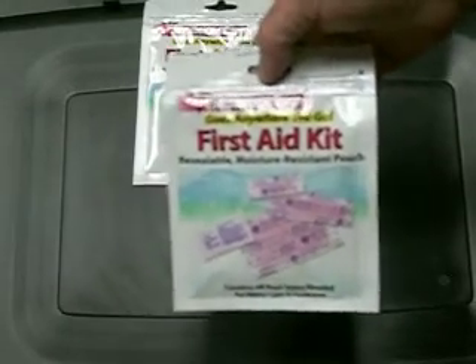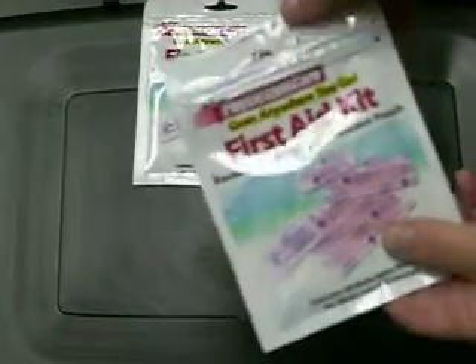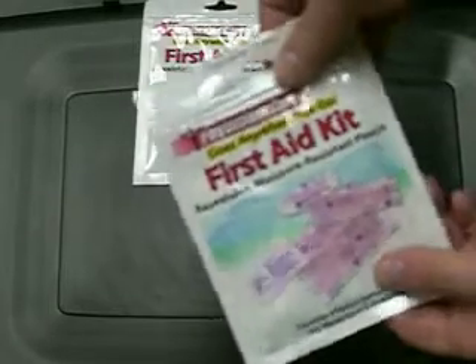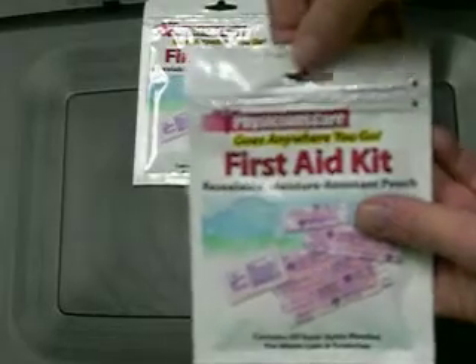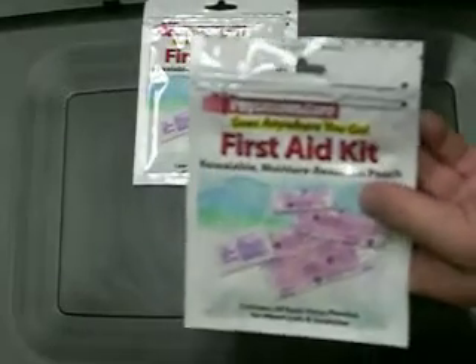Welcome aboard another CountyCom video. Today we're excited to talk about the new Pocket First Aid Kit that we're carrying. The outstanding feature about this is it's in a cryopack container. The neat thing about the cryopack container is it is resealable — almost like food products where you rip it open, then you have a zip lock. You can get to your first aid items and then seal it up and keep the rest fresh and clean.